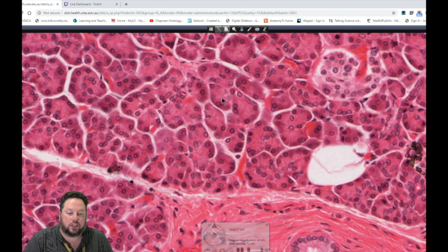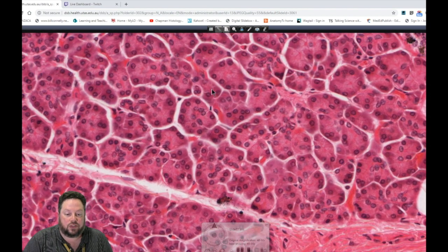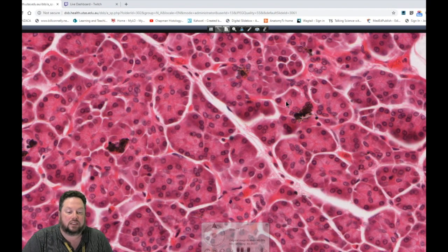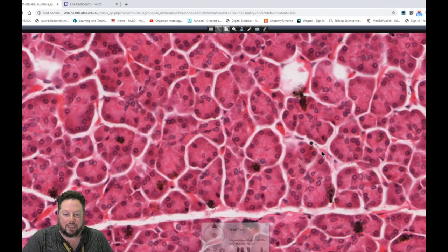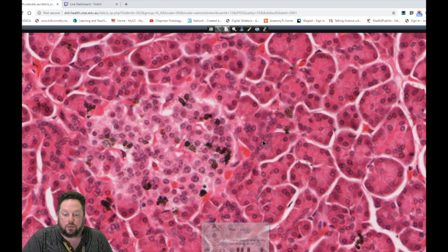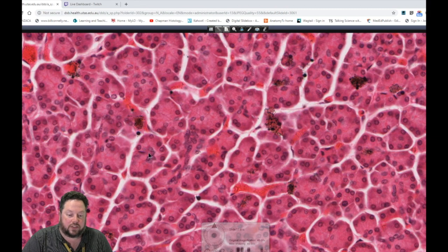So what you're looking for when trying to identify those are the acini, and cells which are located inside them. They're not always that easy to see, and of course, I would never really ask you to identify those. There's some here. See the flattened nuclei? Again, we've got some over here as well. That's part of the duct structure there. These centroacinar cells are located here.